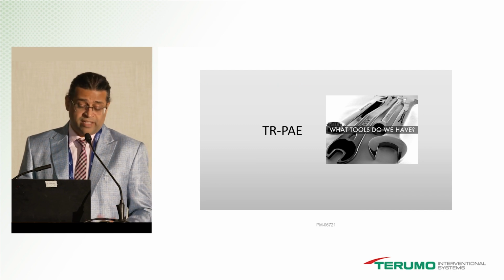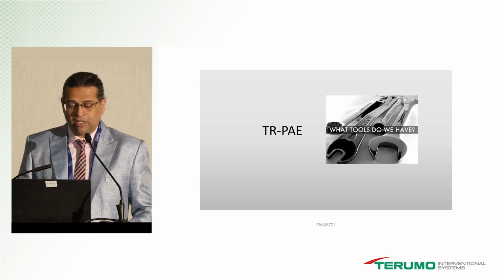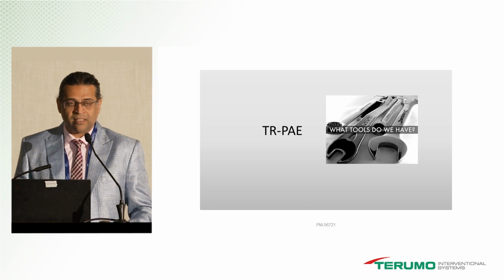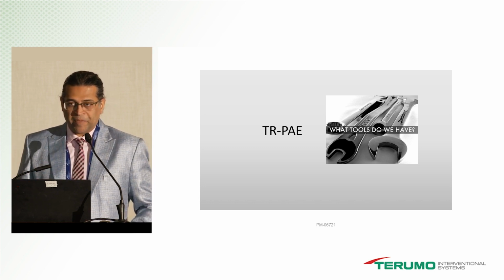What tools do we have? And things have changed over the last few years. With respect to PAE, we don't have all the tools yet. We're still getting there, because with a lot of catheters you need angulation, you need maybe steerable catheters.